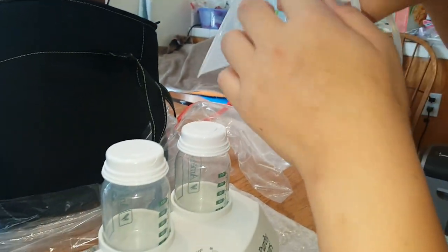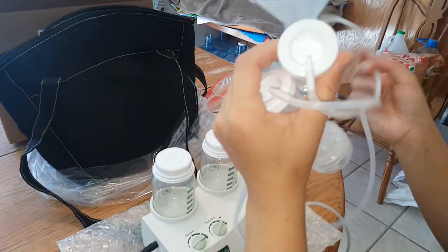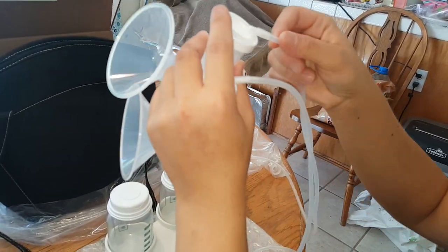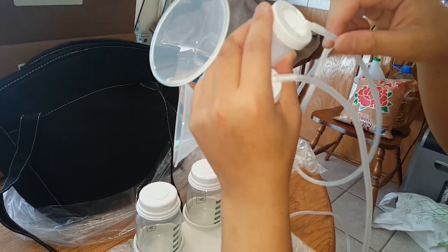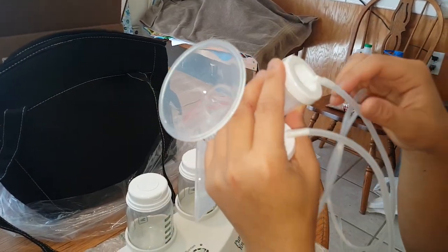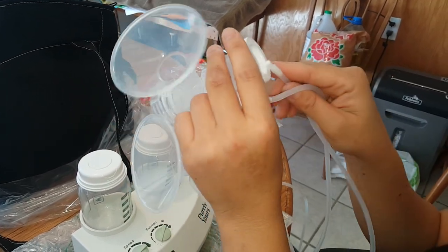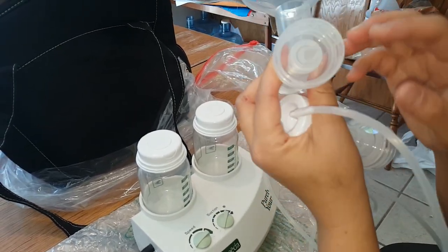So here is your milk collection system. I took it all apart to sterilize it. But you do not want to sterilize these wires here — this is where the air goes in and out, so if you get water in there that could be a problem. I just took these off and then undid everything else to sterilize it.